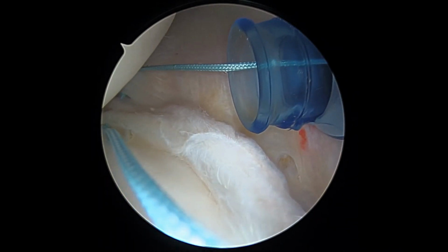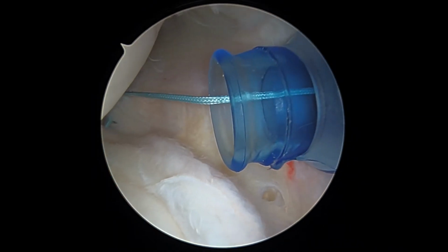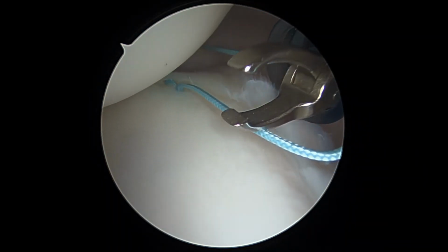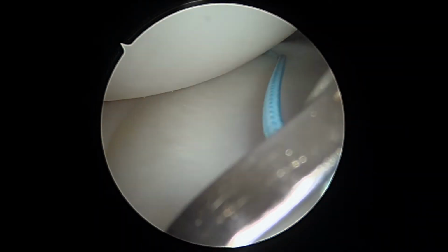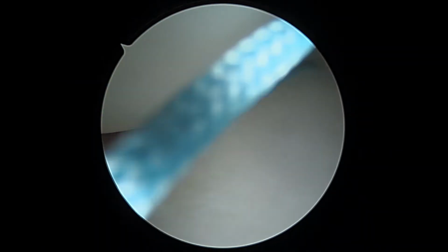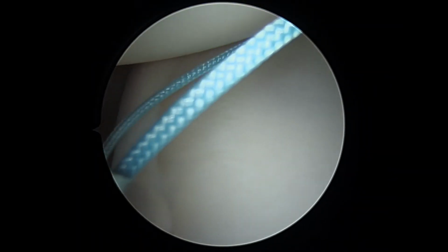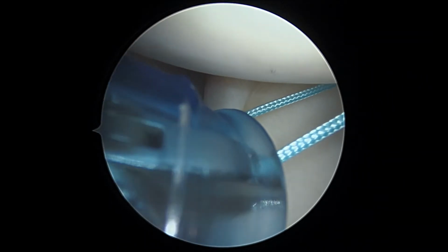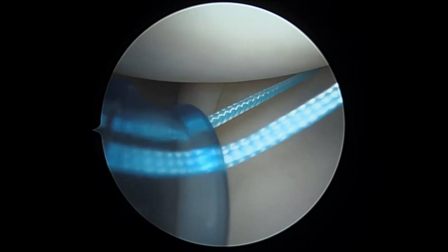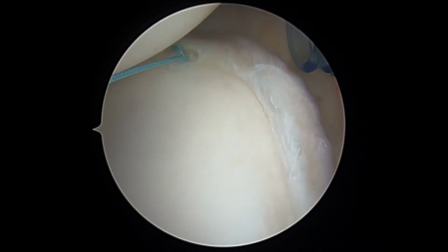We're going to do this stitch as a mattress stitch, which means that I've got to take the next suture out the front also. I'm going to go ahead and take it here and push it over towards the front of the shoulder, which means pushing it this way, just to make it easy to retrieve. And so now I can come in here, and there you can see how we retrieve it right there. Okay. And so now we're going to repeat that suturing process that you just saw and create a mattress stitch.